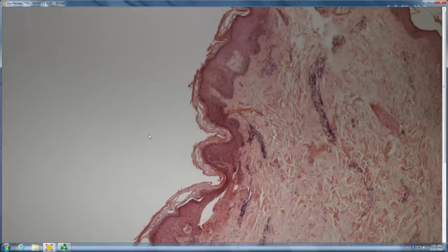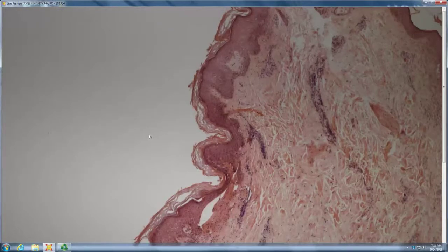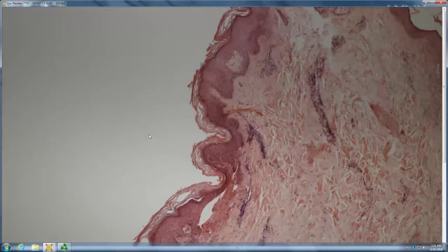Okay. Have you guys seen good images of IgA patterns in DH versus linear IgA? Linear IgA really looks like toothpaste spread along, whereas DH is not only granular, but the granules are vertical. It's a picket fence pattern because they're along anchoring fibrils.